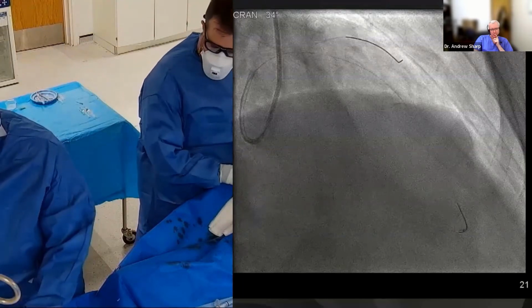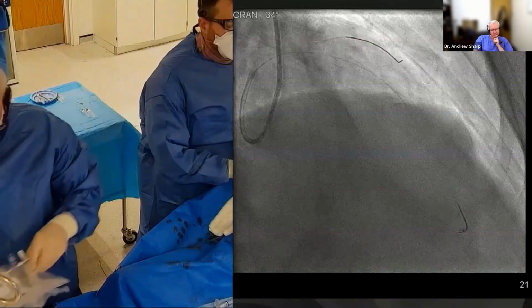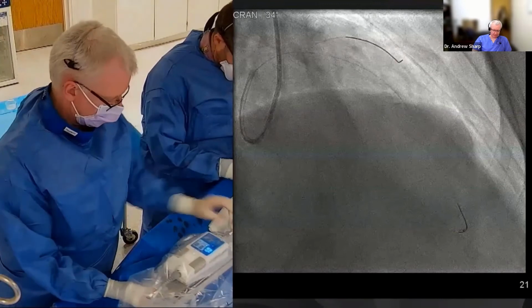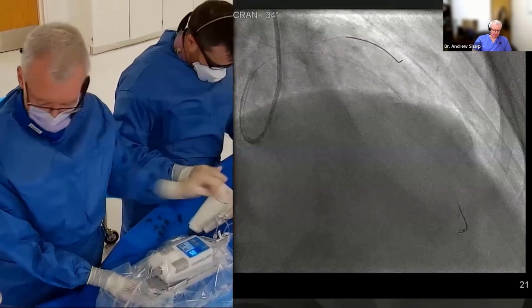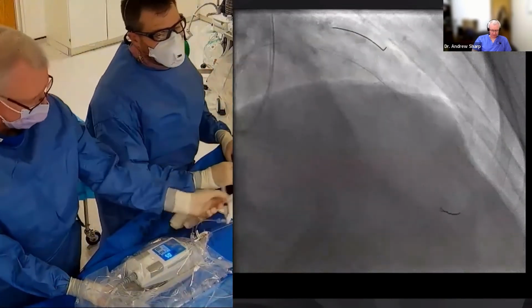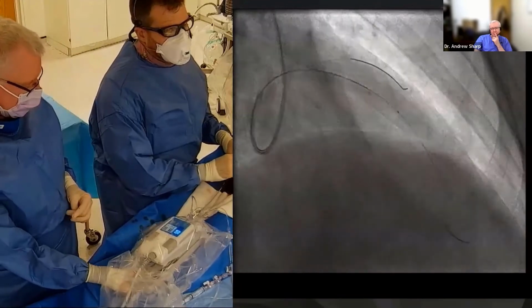Yeah, please. Just follow for me. Just on a touch more.